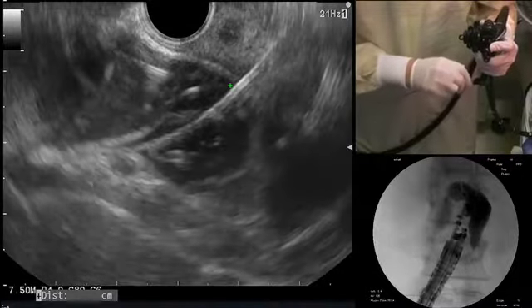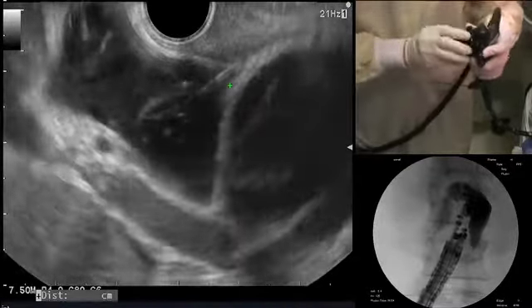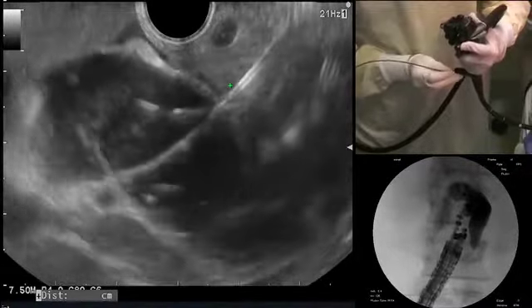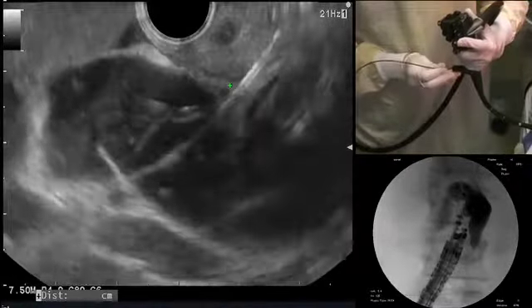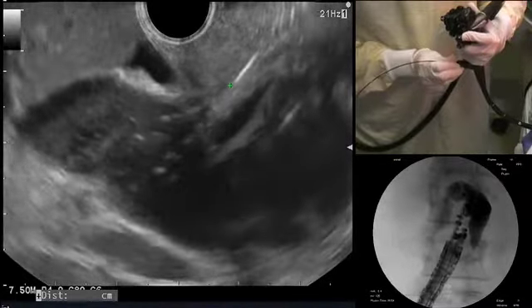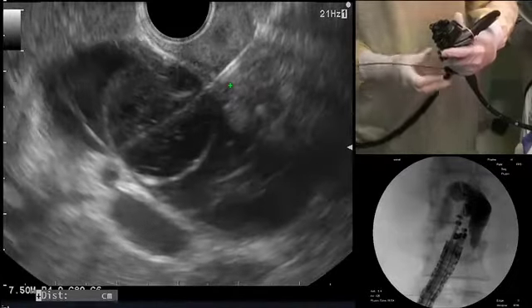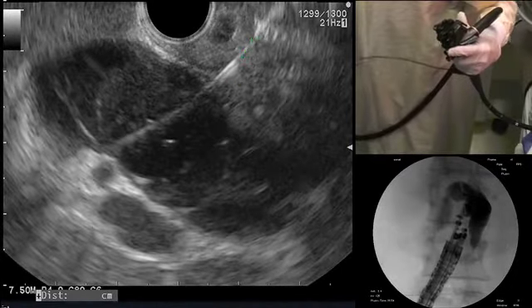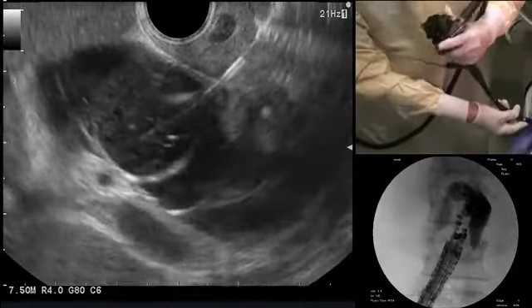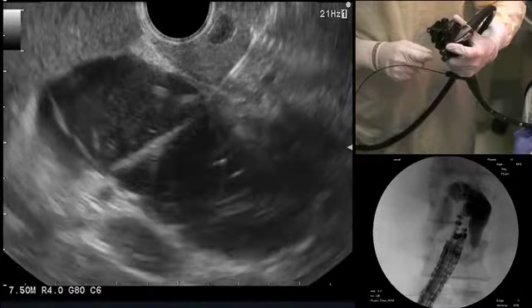In a moment I should be there. I'm feeling something, so I think I'm about there. Having a lot of breathing movements here. Now you see the cystitome coming out — you can see it's very bright, and I'm pushing it up against the wall. This gives you a sense of where the duodenal wall is. The duodenal wall starts here, and the thickness here is almost a centimeter. So we've got a bit of thickness here to deal with, and we're going to have to burn through that duodenal wall thickness with the cystitome.